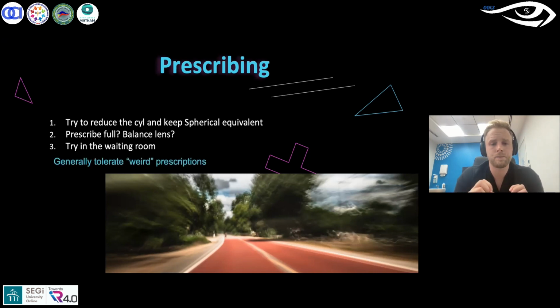Keratoconic patients are used to having really, really strange vision, okay? As you can see in the photo below, they're used to tolerating these higher order aberrations, this astigmatism at oblique angles. So generally, they actually cope much better with the refractive results than you would assume a patient going into a 3 diopter oblique cylinder or 4 or maybe even more than that.